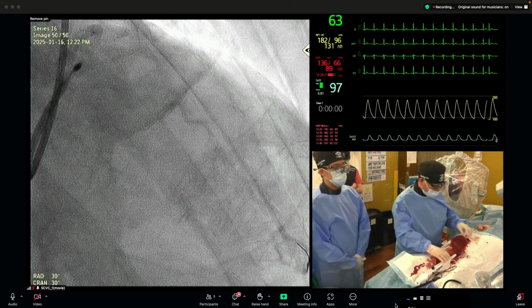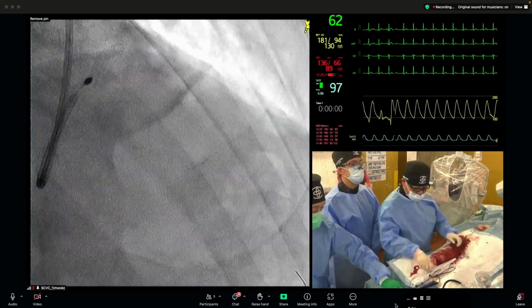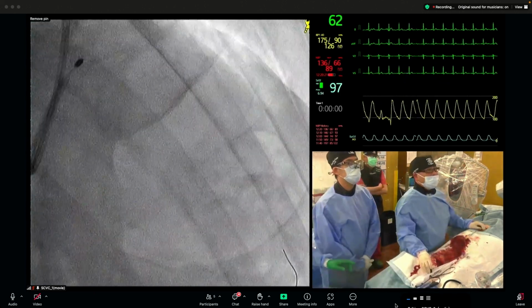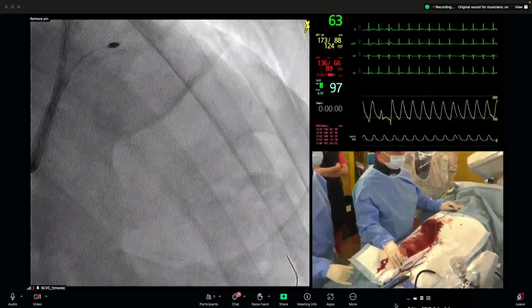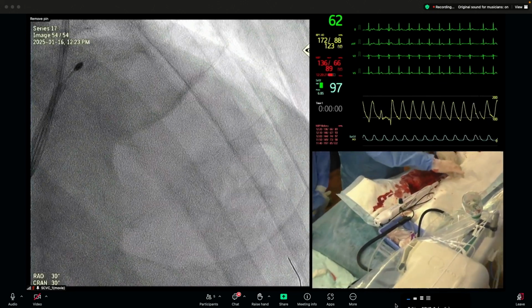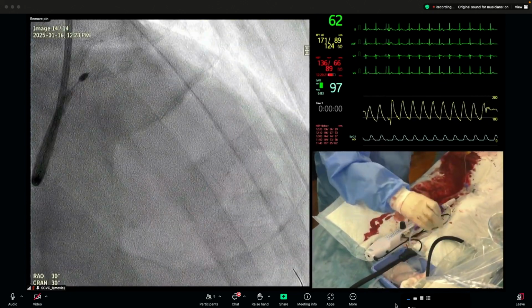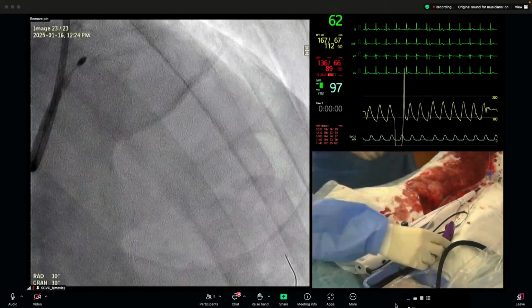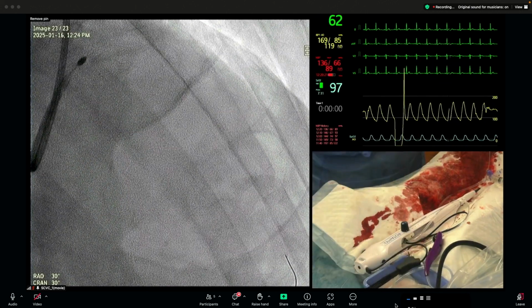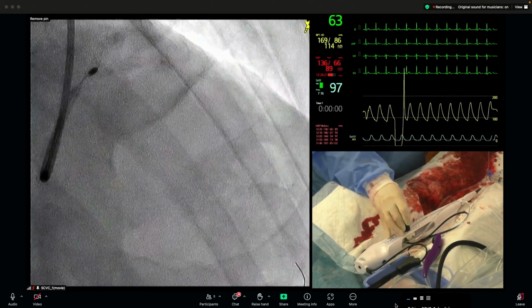This is Hyunchul Kwon from Samsung Medical Center, Korea. And I agree with Dr. Low about the indication of rotablation. Usually I only use rotablation for encircling calcium, but I have noticed that the burr-to-artery ratio in your planning for rotablation is very high. You're considering using 2.0 or 2.15, which may be beneficial for stent expansion.